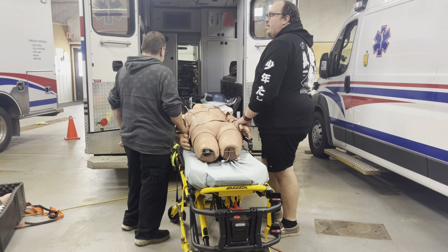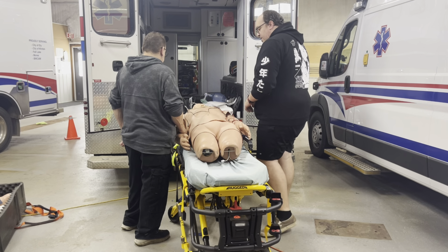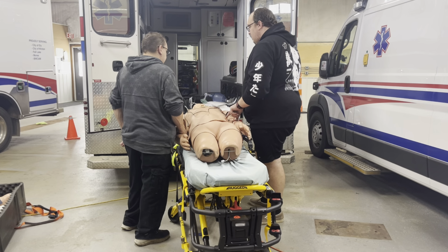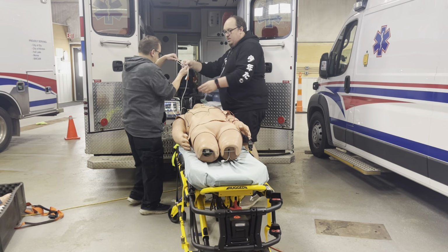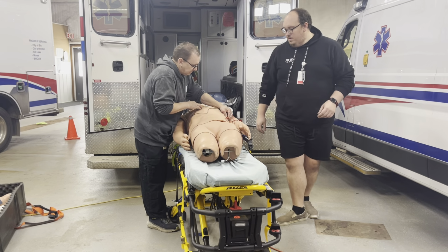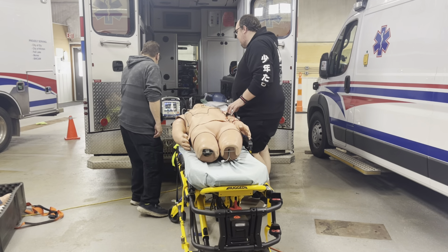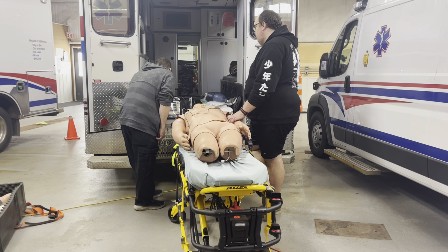Unfortunately, it didn't do anything either. Kicked up a little bit, but then immediately went right back down. Now what do you want to do? Pace. Yep. So here's your pacing pads. Red goes on the side on our mannequin, and the white one goes up on the top shoulder. Alright, so you're gonna pace him, and you can pace him with our monitor at full dose.